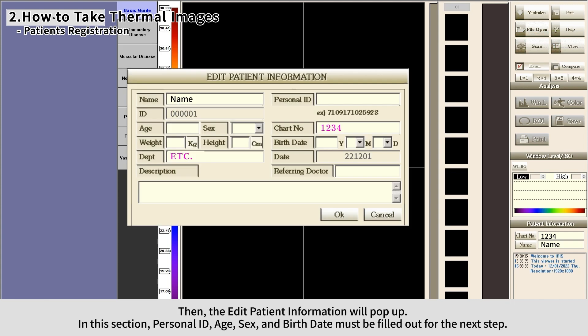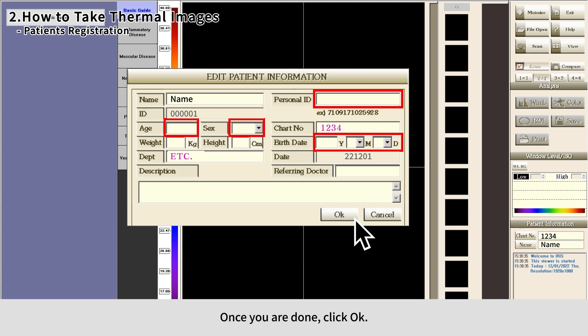The Edit Patient Information window will pop up. In this section, personal ID, age, sex, and birth date must be filled out. Once you're done, click OK.